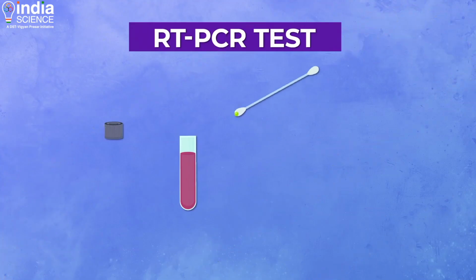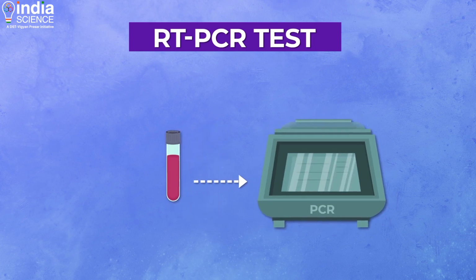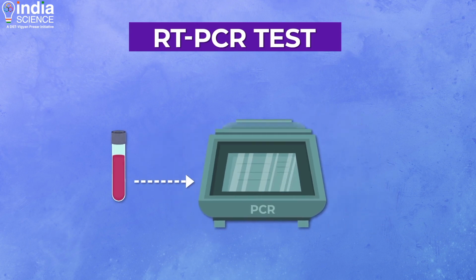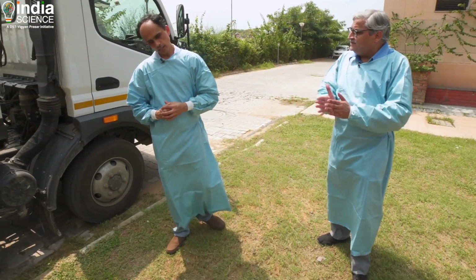That is collected in a virus transport medium, and the medium is brought into this lab, where people have specialized skills to extract nucleic acid from this sample, and the PCR machine detects the nucleic acid by amplification of whatever little amount of nucleic acid there is. That's RT-PCR. What about the others, which are the antigen and antibody tests?